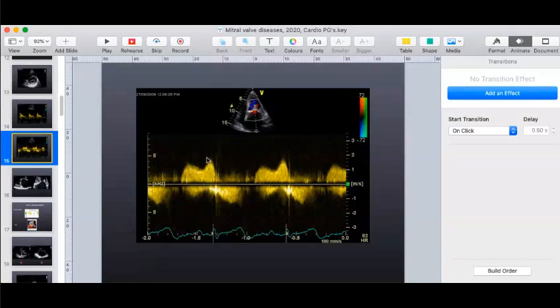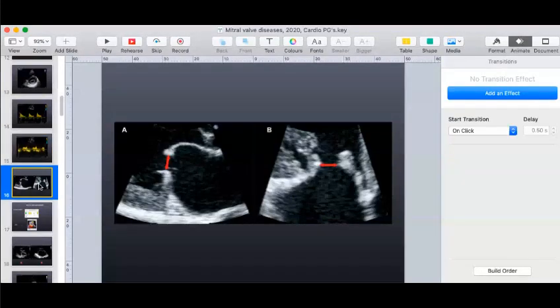And the last part of the flow, which is getting into the left ventricle, that is boosted by the atria, is this part. So you have a lower early part and then a taller last part. And this is suggestive of a left ventricle which is stiff, where the compliance is not there and the relaxation is impaired. And that is the reason why this early flow is not happening. Is that okay? Okay, sir. Right. So what method would you call this in the assessment of mitral stenosis?